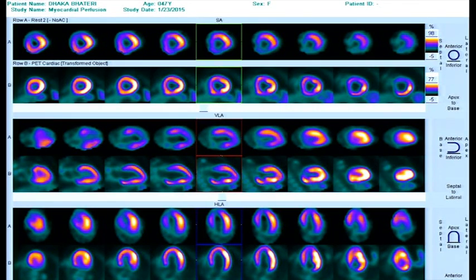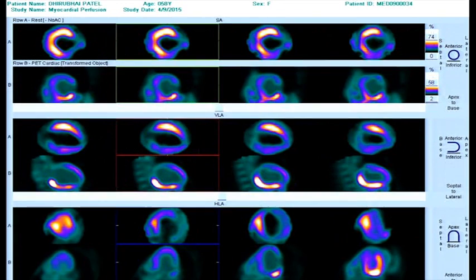This is another patient where you can see an anteroseptal perfusion resting defect, where the PET image shows FDG metabolism, a mismatch, with perfusion absent and metabolism present, suggesting hibernating or viable myocardium. Here you can see a beautiful case of dilated ischemic cardiomyopathy, where the ejection fraction is 18 to 20%, and the patient has been referred to us to find out the FDG viability.